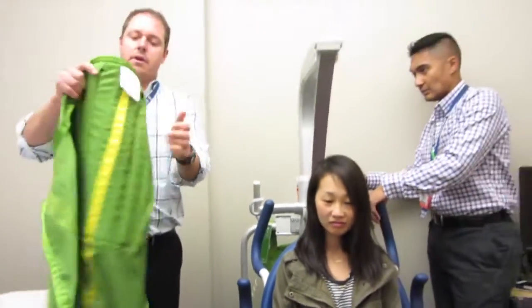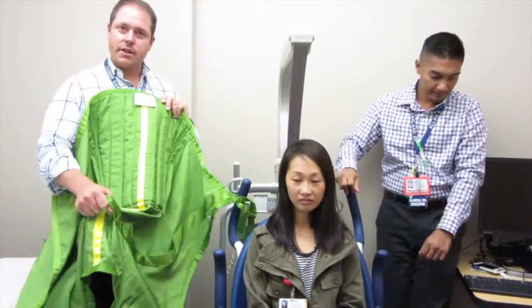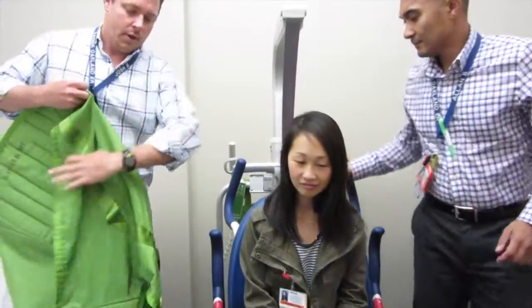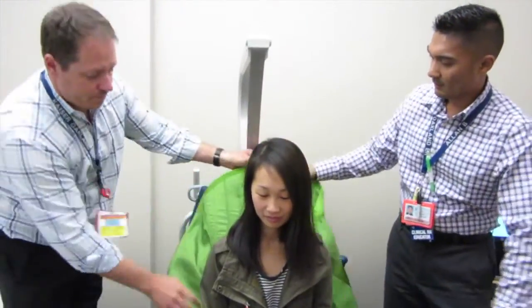The sling itself, you always want to be able to see the stripe on the outside. The other tell is you want the handles on the outside when you're putting this around the patient. So we'll ask Christine to go ahead and lean forward, and we'll slide this around behind her, bring it all the way down to her sacrum.